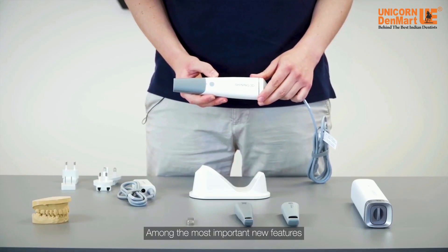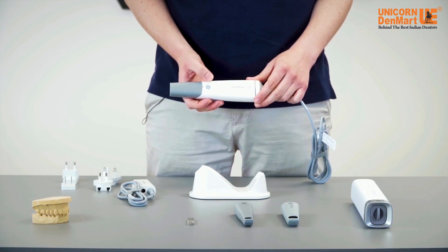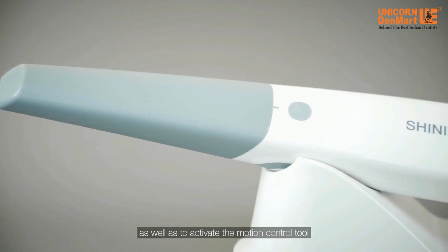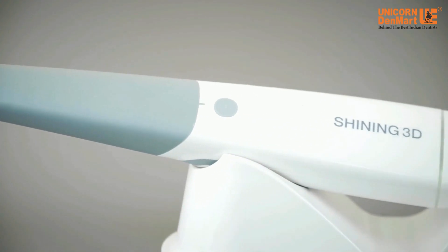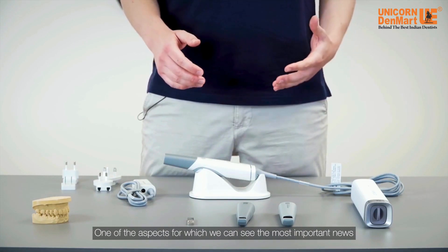Among the most important new features, we can see the button at the central part of the scanner, used to start and stop the scan as well as to activate the motion control tool, as we will see later.